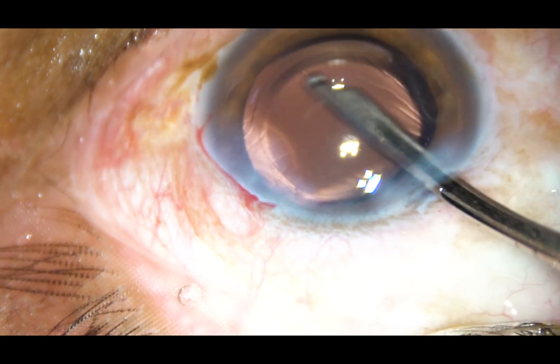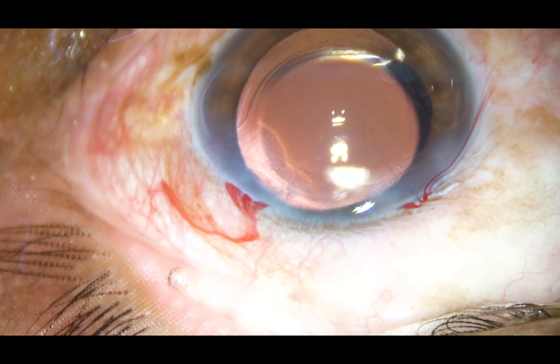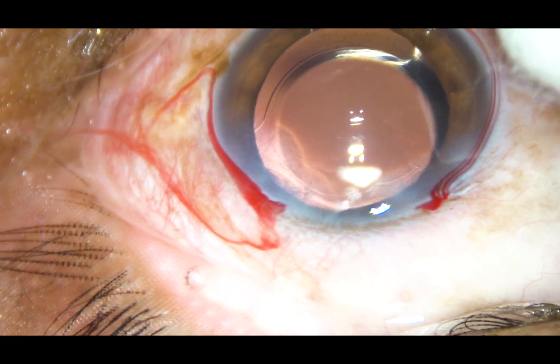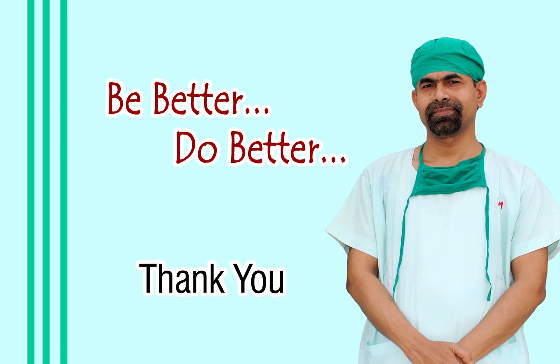The surgery is done. You can see that the anterior capsular rim has overlapped the optic of the intraocular lens all around, indicating that it is a good rhexis. Thank you very much for watching. The aim of these videos is to inspire you to improve your skills. Hope this video will help you in your practice.